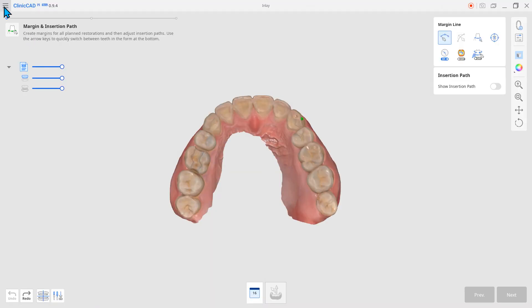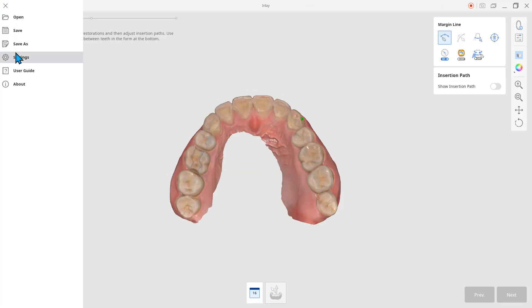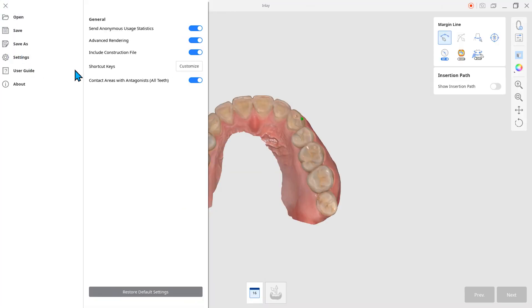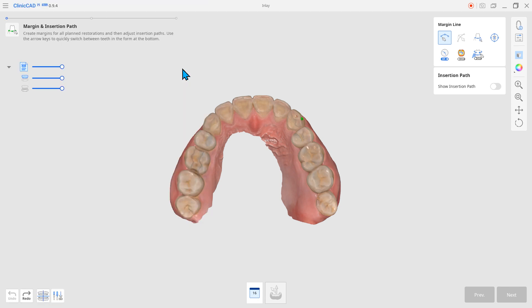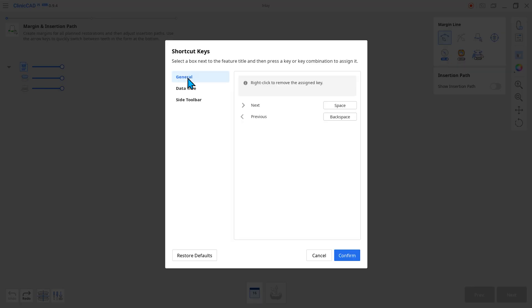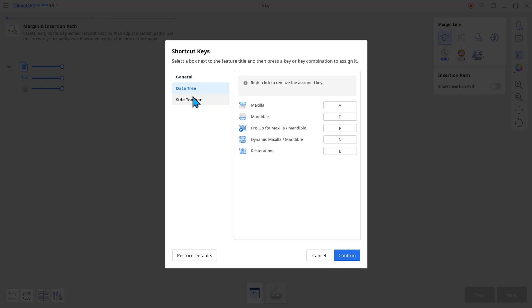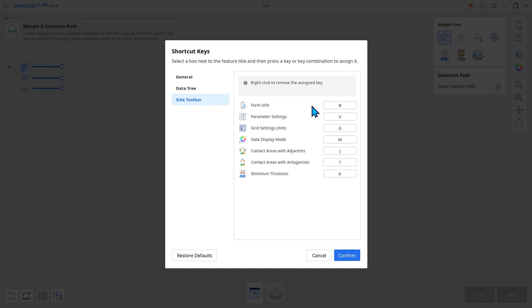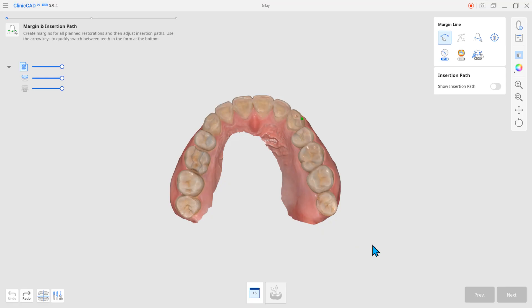This update also includes a shortcut key option for tools in the data tree view and the side toolbar. You can customize the shortcut keys and check for them by hovering the mouse over the feature icons.